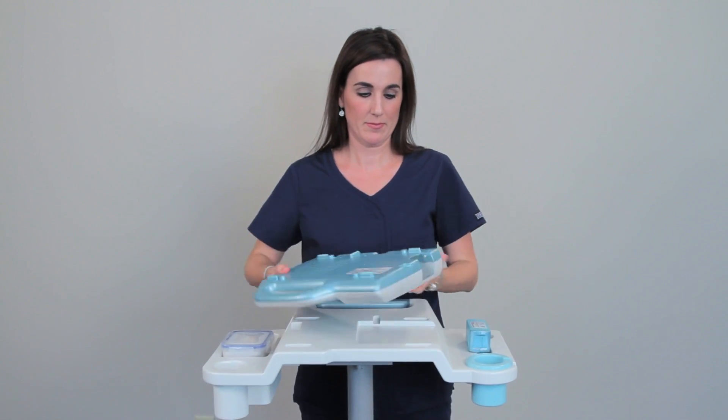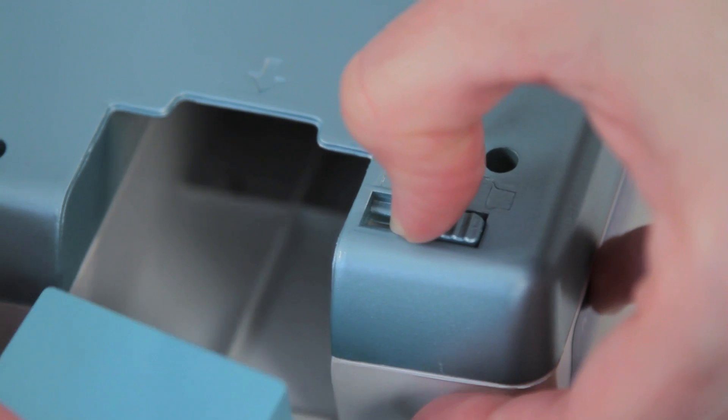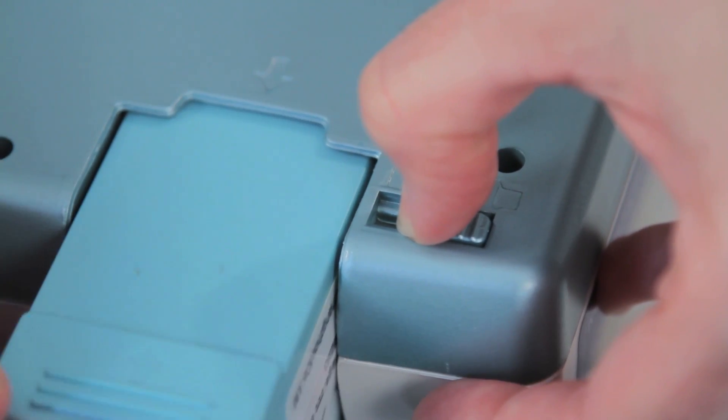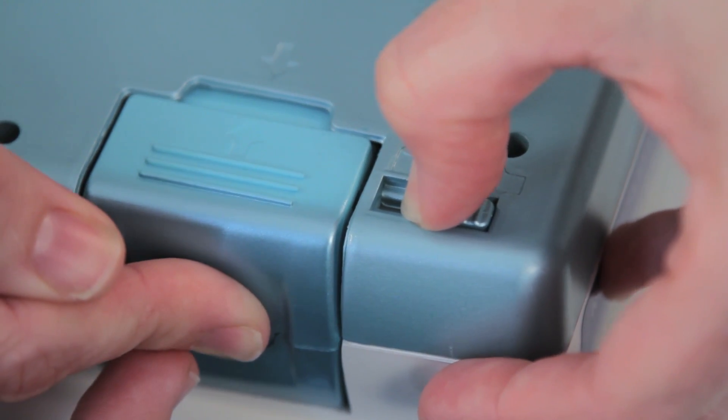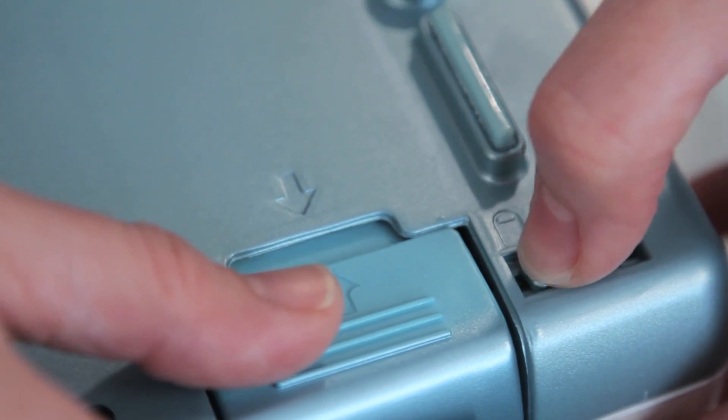There are a couple of easy but important steps we must take before turning on RosyScan. First, make sure that you properly insert the battery. Pull the plastic latch back completely and slowly insert the battery inside the slot. Make sure that you hold the plastic latch while inserting and removing the battery.